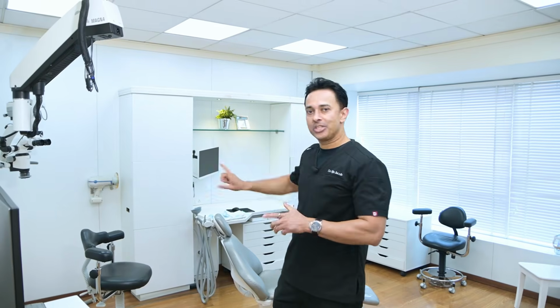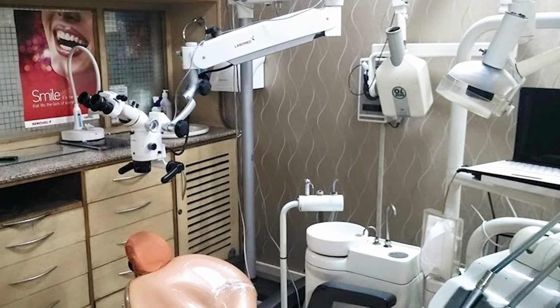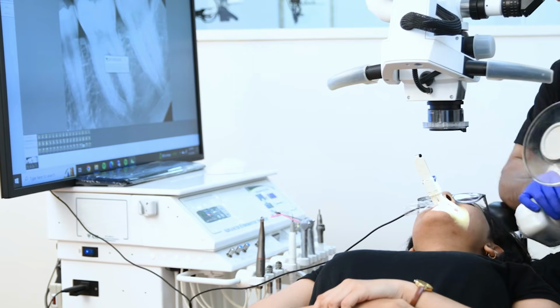The second arm, which tends to crowd most operatories, is the X-ray arm. What we have done is we've switched over to a cordless X-ray machine, a handheld one. So again, it eliminates one arm completely. So that again adds to the roominess.